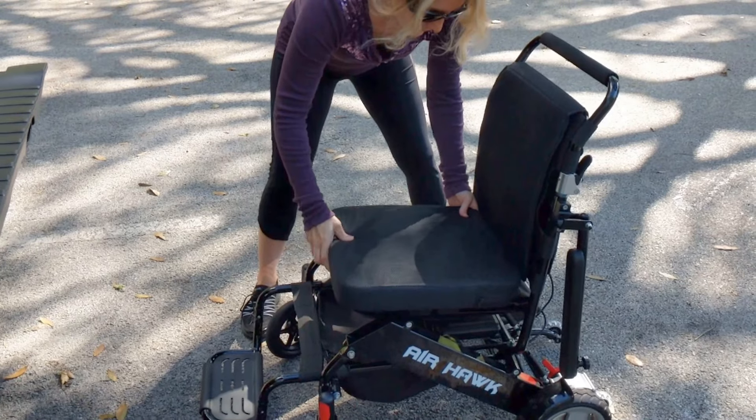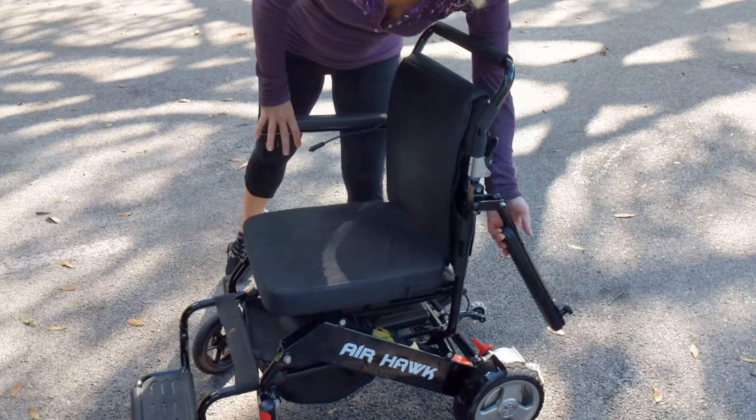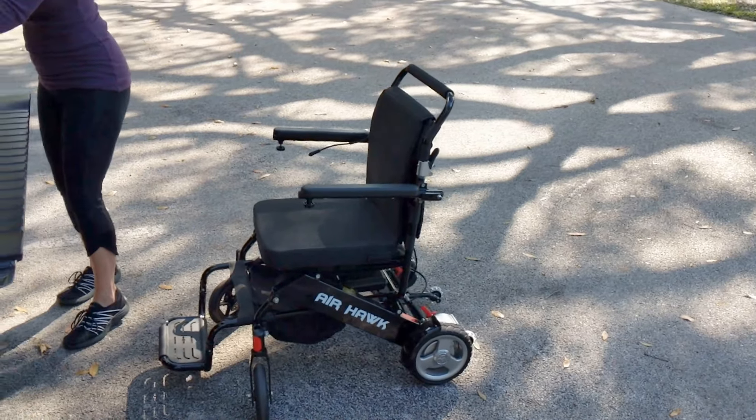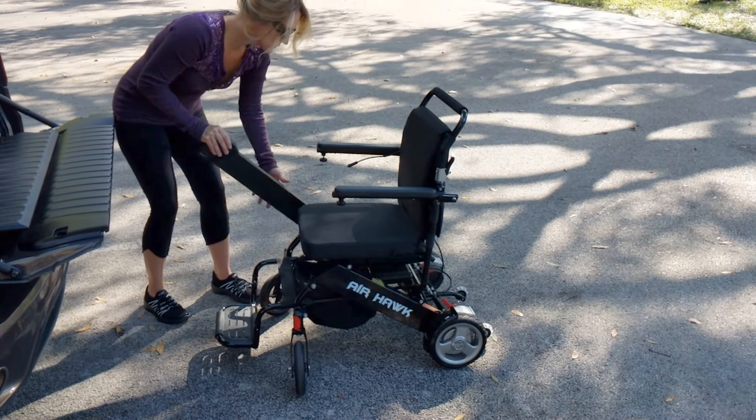Taking the cushion out — that easily stows underneath the seat for very easy storing. Folding the arms around and we're literally just a few seconds away from making this a live power chair.